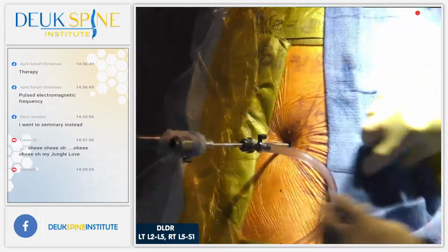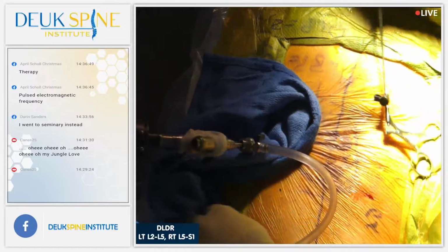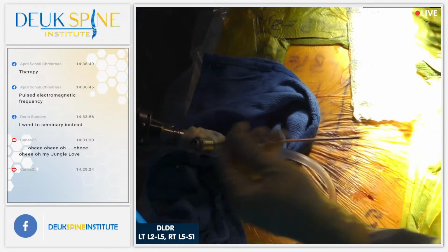We have another question. I can see. Yeah, that's perfect. We're definitely inside the disc at 5-1. Go ahead.